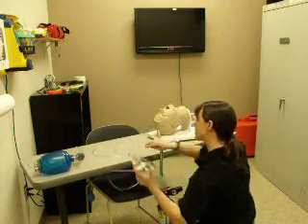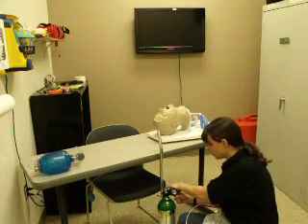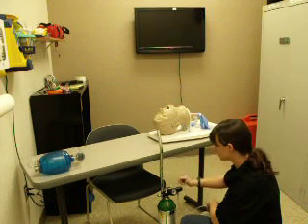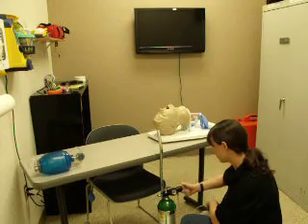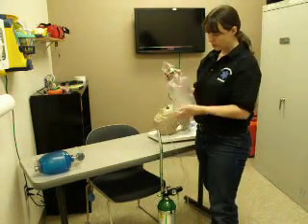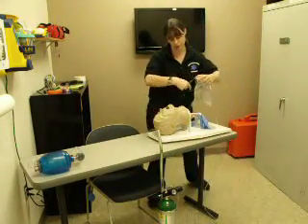I'm going to select the mask and attach it to oxygen. I'm going to set it at 10 liters per minute or greater, so in this case I'm going to set it at 15 liters per minute. Pre-filling the reservoir to make sure that there's enough oxygen for my patient when they take that first breath in.